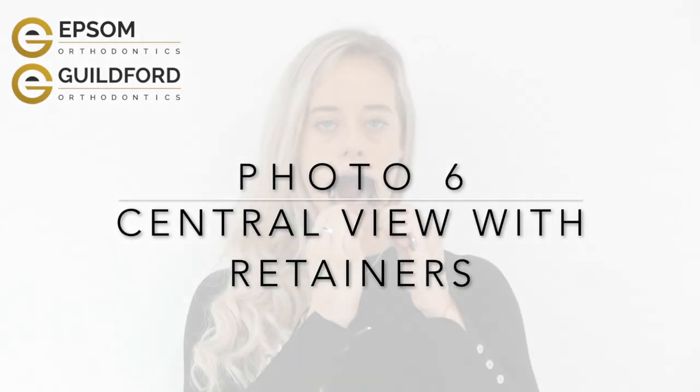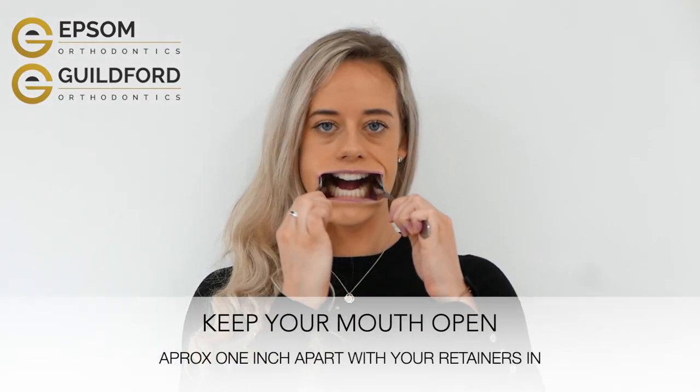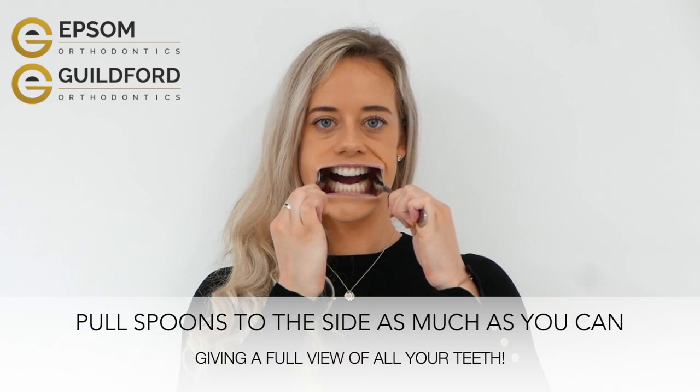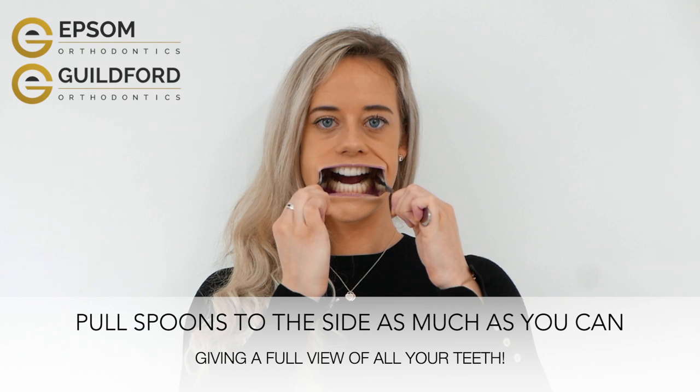For the central view, with your retainers in, keep your mouth open slightly. Pull the spoons away from your teeth as much as you can, giving the camera a full view of all of your teeth.